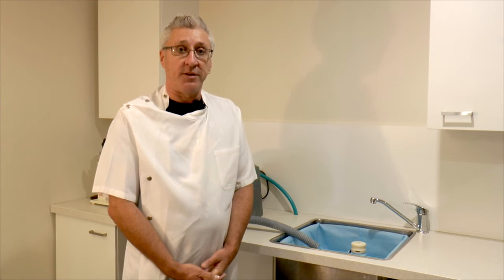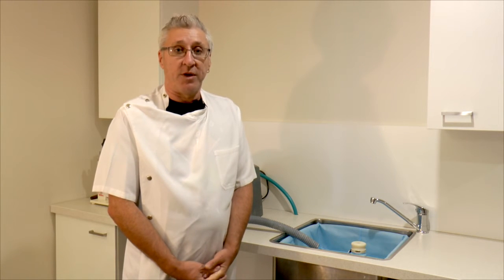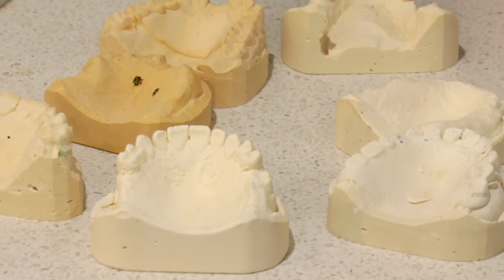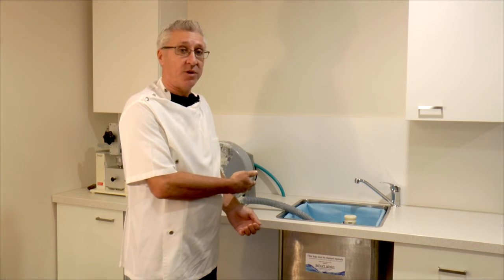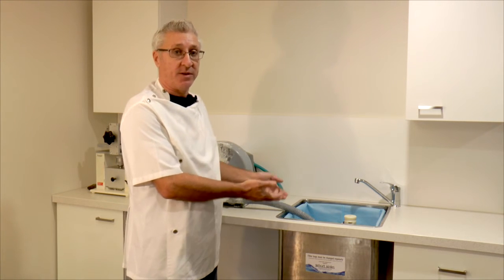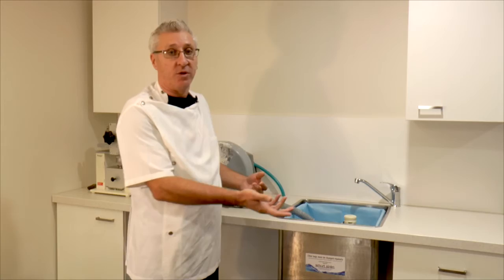But with the new SmartSink, everything has changed. Much easier to clean — it takes five minutes. The bags pop out. There's no smell. There's no blocked pipes. So today, what we're going to show you is how the sink works, where the waste water goes, and how easy it is to clean the sink out compared to the older style.